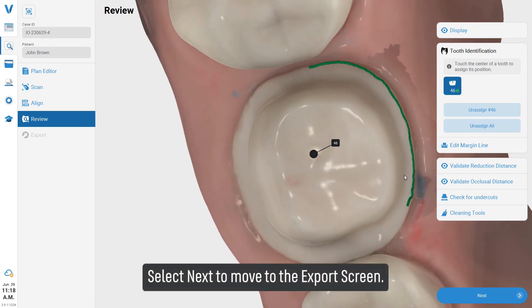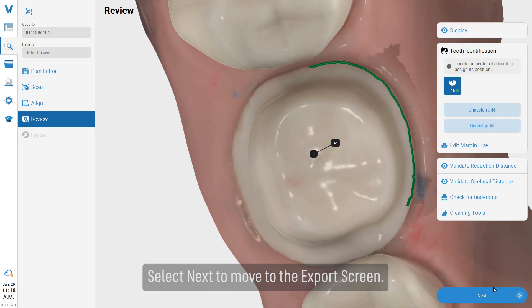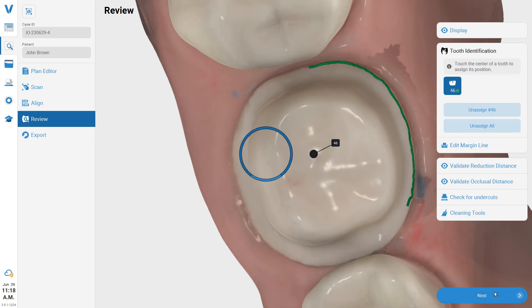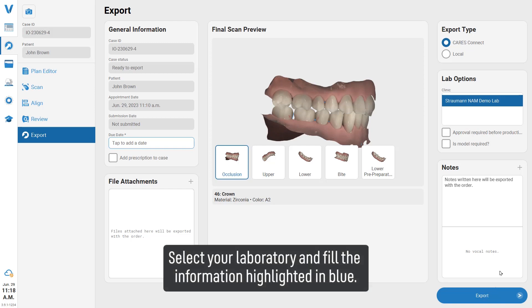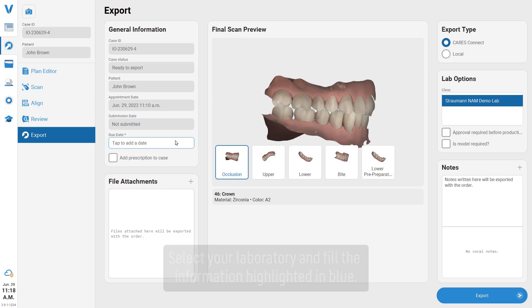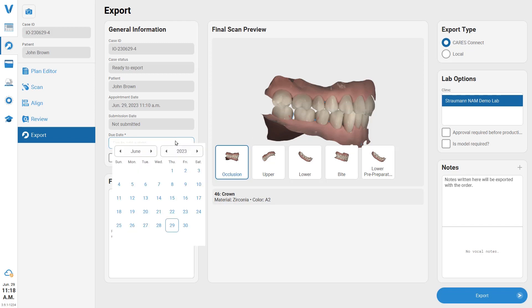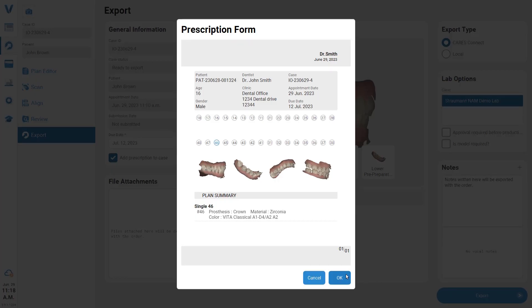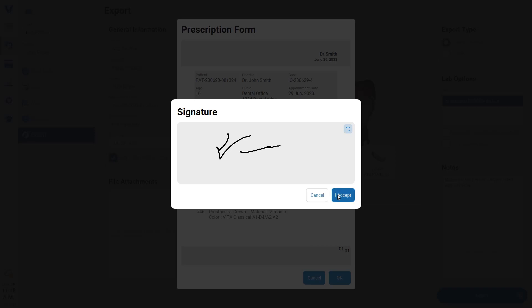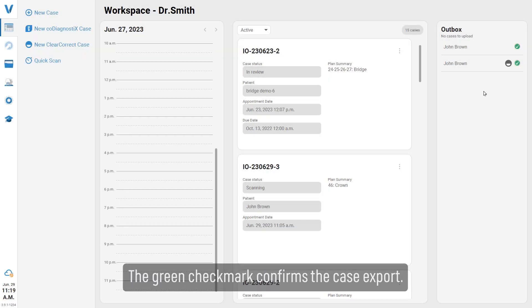Select next to move to the export screen. Select your laboratory and fill in the information highlighted in green. The green check mark confirms the case export.